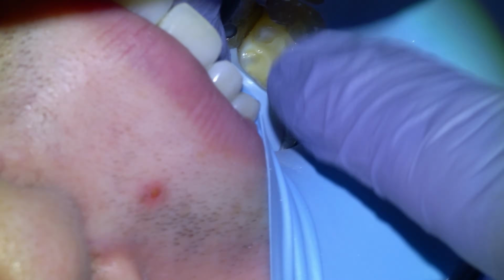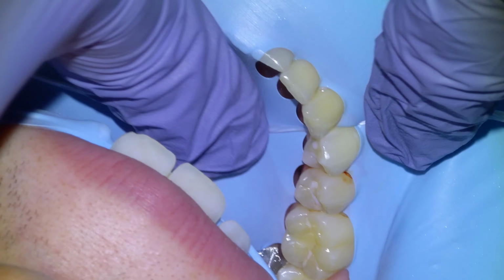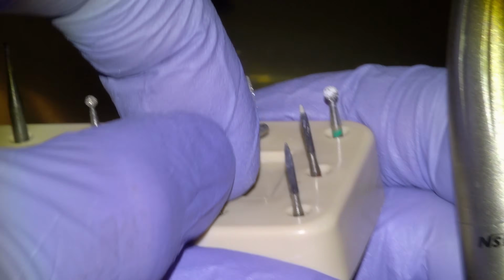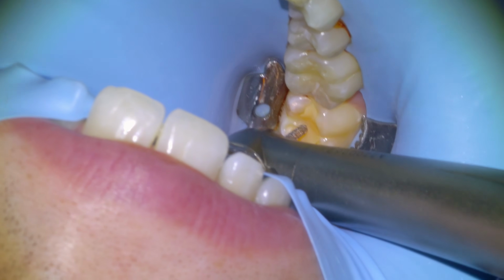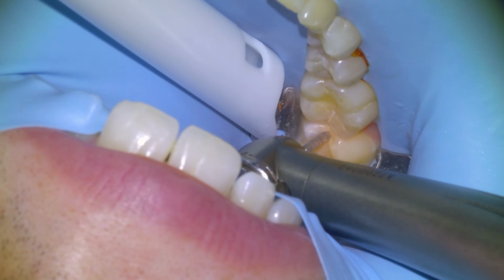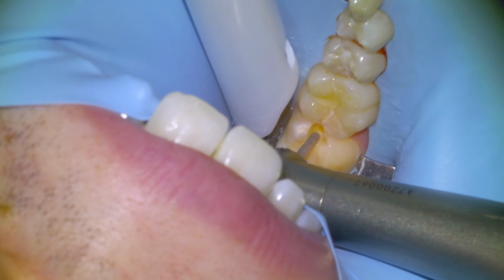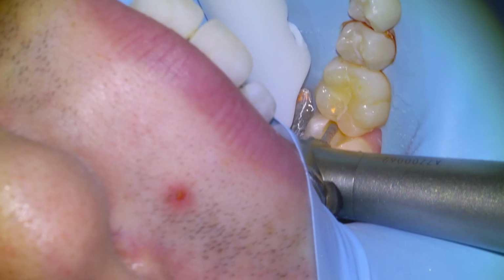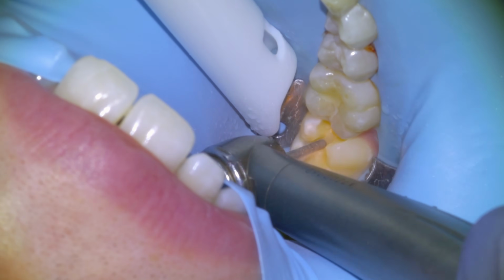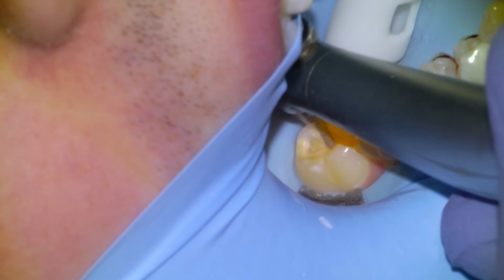Going to start by getting a rubber dam on. For isolation, I like the rubber dam as opposed to other isolation methods. You can use a KS1 burr for initial reduction. There is an occlusal composite in there that we're going to prep out and make sure that we get all of the composite from the pulpal floor, which is always a little tricky to do. You kind of got to go back and forth with drying the tooth and inspecting to see if there's composite.